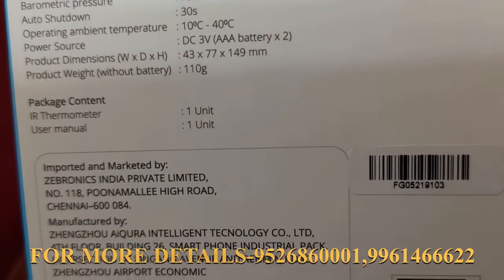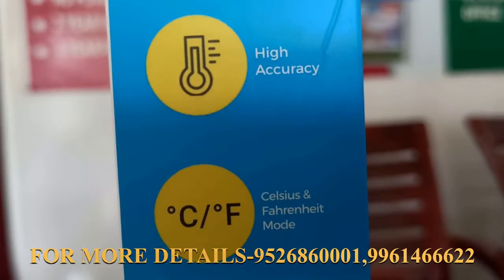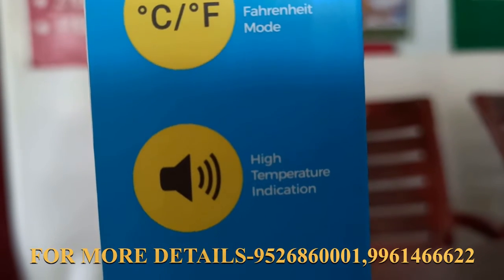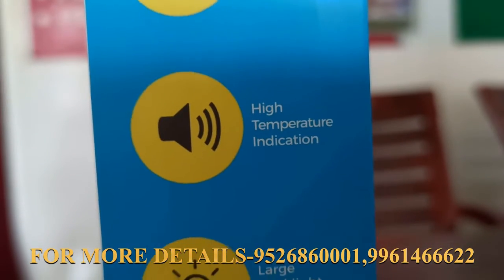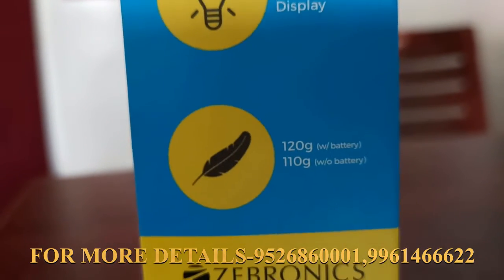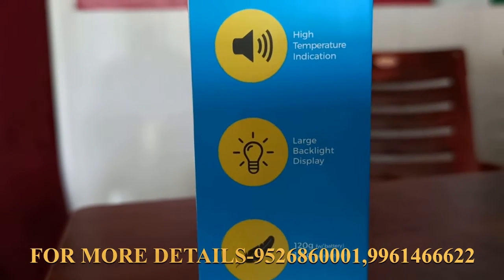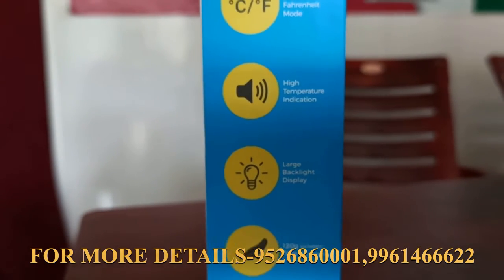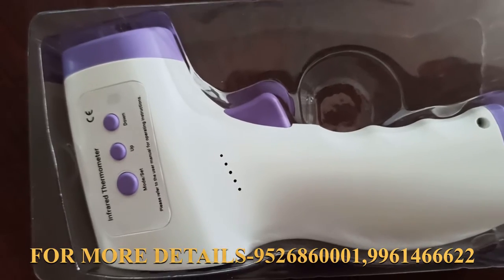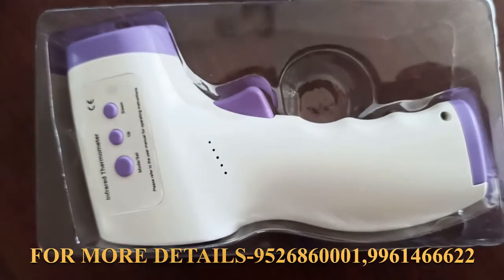This shows the temperature reading in our shop. The display shows the temperature in degrees Celsius, along with a temperature alarm and display indicator. The temperature reading will be activated on the screen.